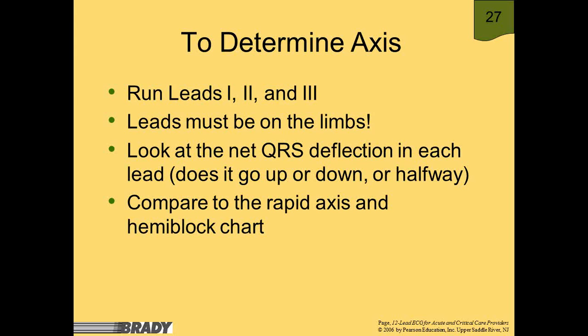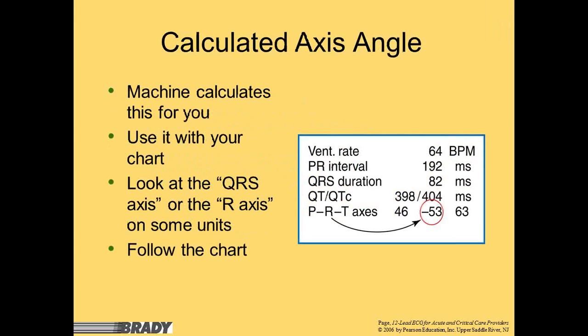And then we're going to look at this chart that I've got for you. I have put this chart on your course page so that you can see it from there. But I think you're going to find it very handy to use for this. None of this is hard, and it's really easy because when you do a 12 lead, it automatically calculates your angle or your degree of deviation.